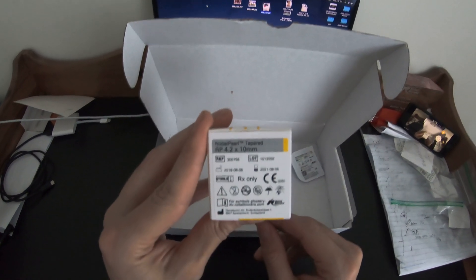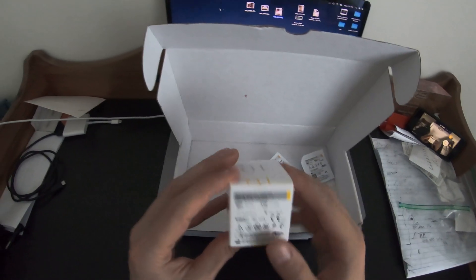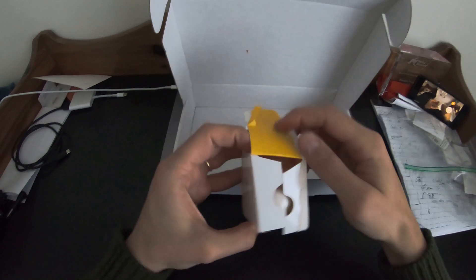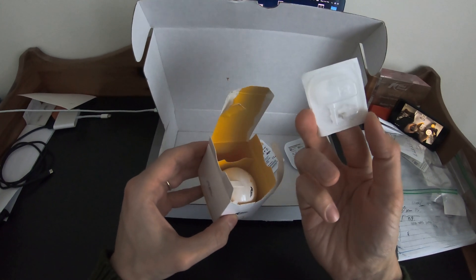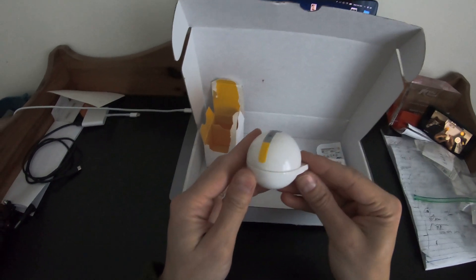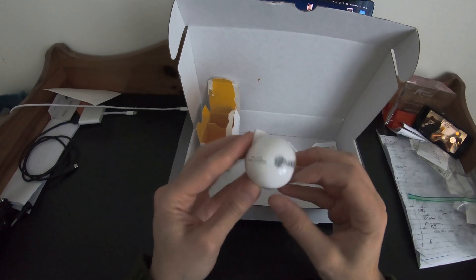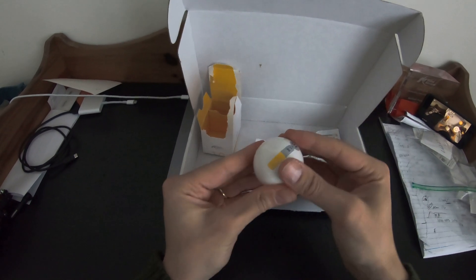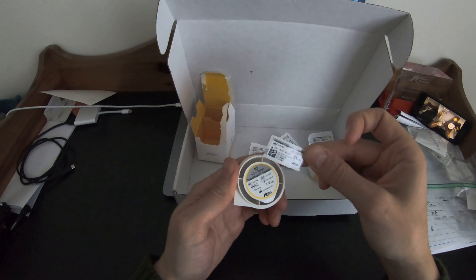Very straightforward — nice packaging, very informative. 4.2 by 10, regular platform, comes with cover screw, full zirconia. This is not a Pokemon ball — yes, this is a real implant. 4.2 by 10, nicely labeled stickers for the patient chart. Pretty straightforward — screw on, screw it off. Looks like we have a sticker already cut out for the patient chart. Very nice.